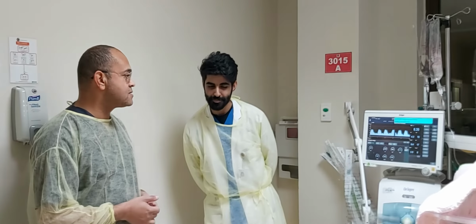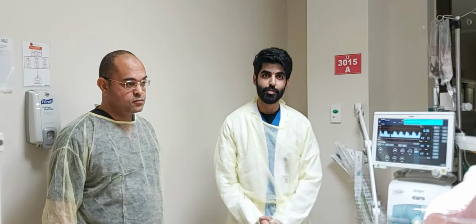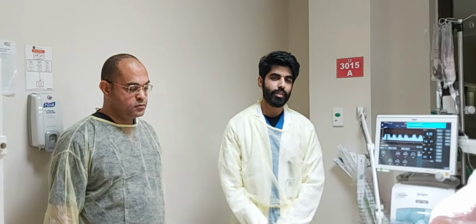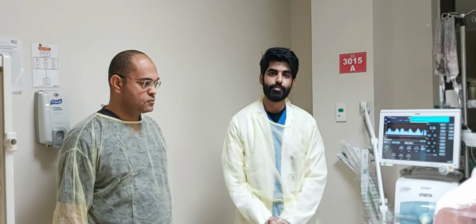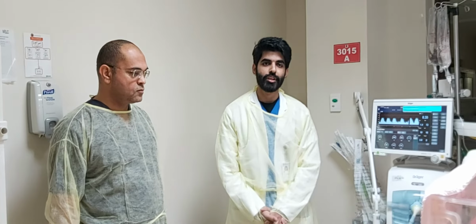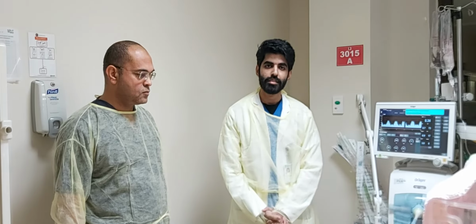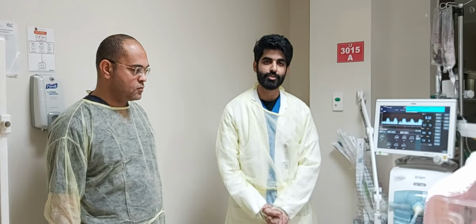Mr. Anas, please. First of all, what is high frequency ventilation? High frequency ventilation basically is CPAP plus wiggling. And when do we use the high frequency ventilation? When the patient is having respiratory failure with the blood gas showing severe acidosis, pH around 7.1, CO2 around 90s. Then after that you can apply the high frequency ventilation mode.